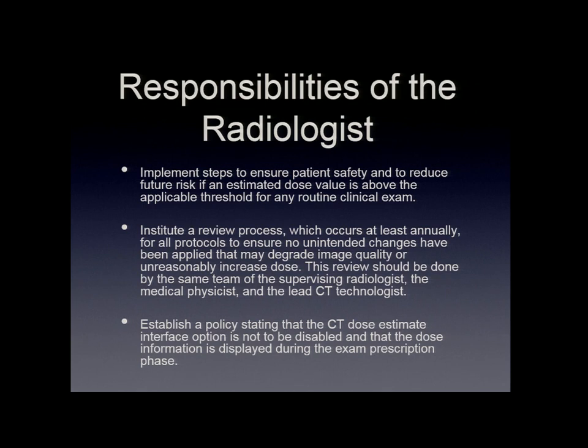Also, they should establish a policy to make sure that these dose estimates interface, that means conveying the information to the PACS and making it available for future reference, that it's not disabled, so that the dose is retrievable in some form. So it is recommended that they do that for all of the different exams that are available.